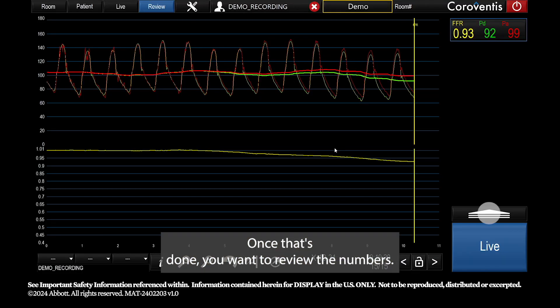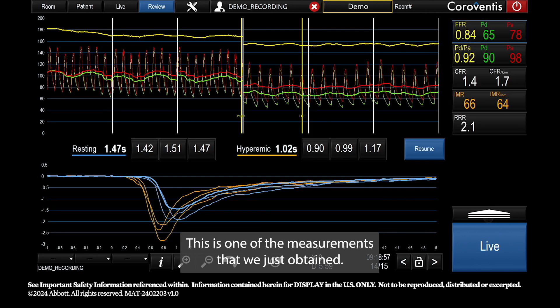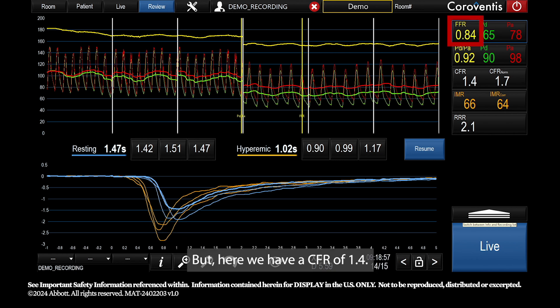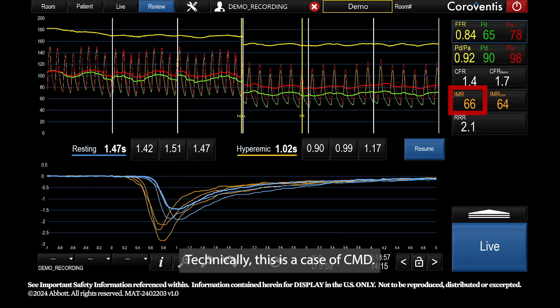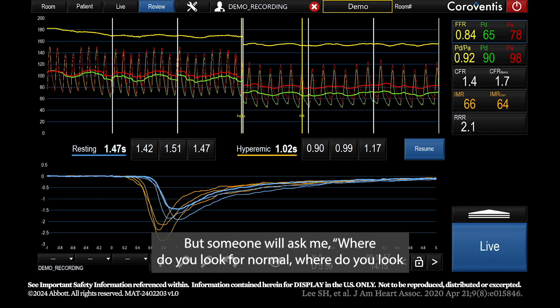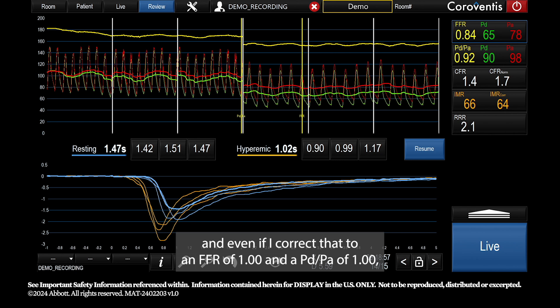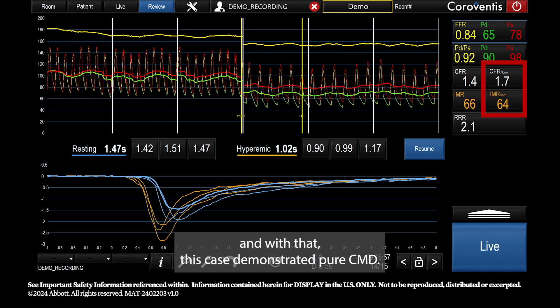Once done, review the numbers. Here we go — FFR is 0.84, though I prefer the value recorded at the end as it's more stable. We have a CFR of 1.4 and an IMR of 66. Technically this is a case of CMD. RRR is also consistent, being less than 3.5, meaning resistance throughout the whole cycle was abnormal. Even if I correct to an FFR of 1 and a PD over PA of 1, I still have a very abnormal CFR and IMR. This case demonstrates pure CMD.